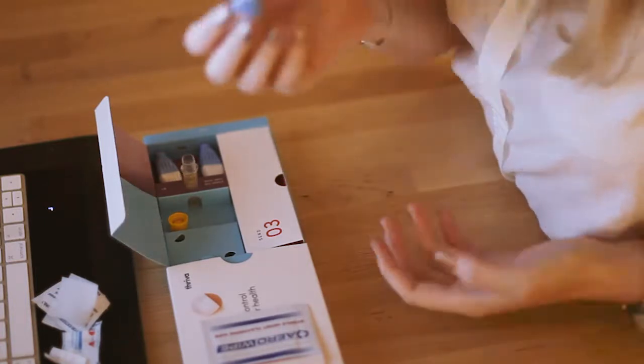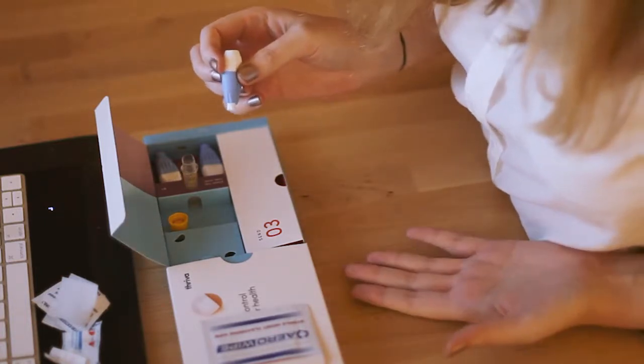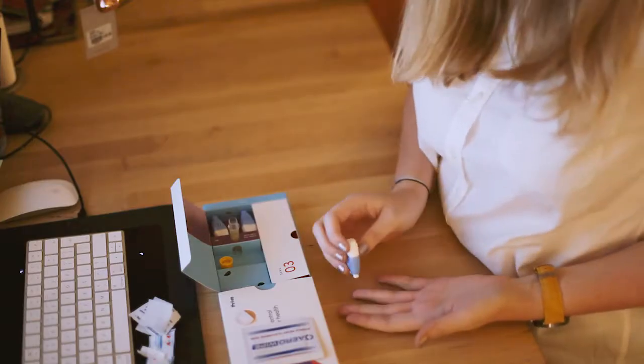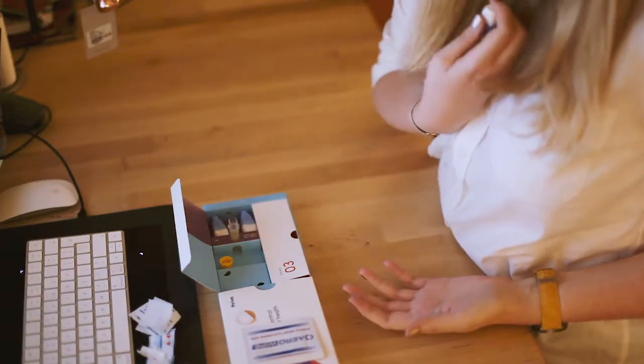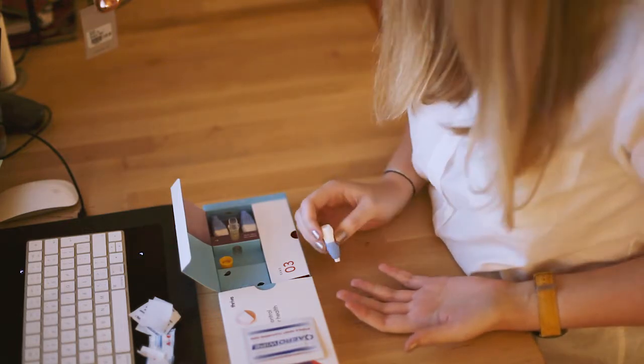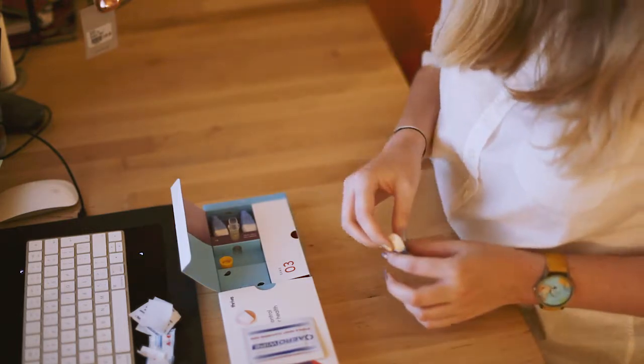So this is my lancet. I just need someone here to prick it and then I'll be fine. Even just holding it against there I'm getting — I don't want to do it. Which is ridiculous, it's not that bad.